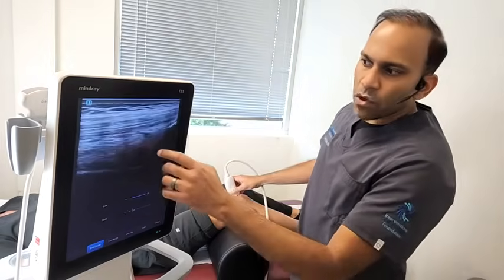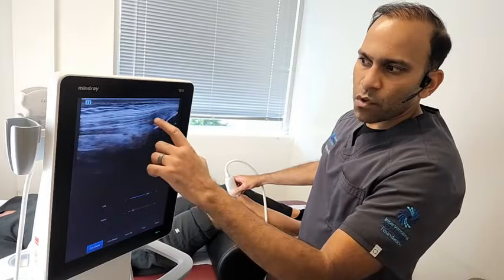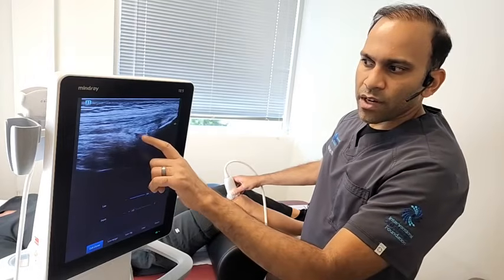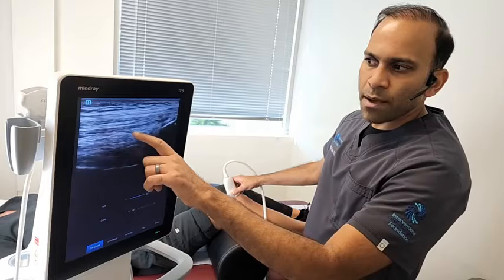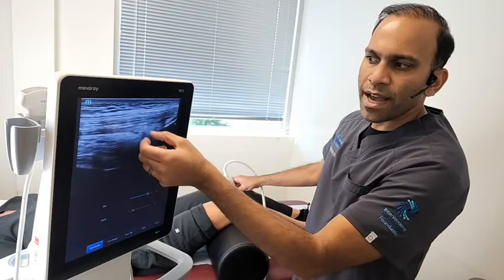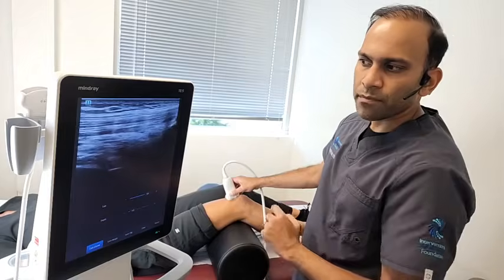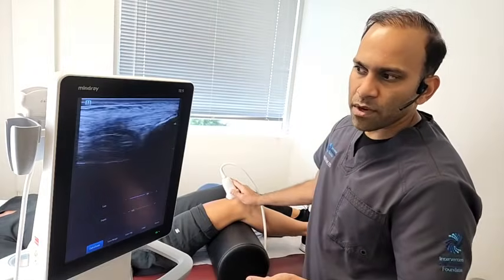So when we look over here, we have the kneecap, we have the tendon of the quadriceps muscle, and in between these two areas you see this black line that's right here. That's actually part of the joint capsule, and if this was completely black and wider, thicker, then we would say that there's some inflammation or fluid coming from within the joint.